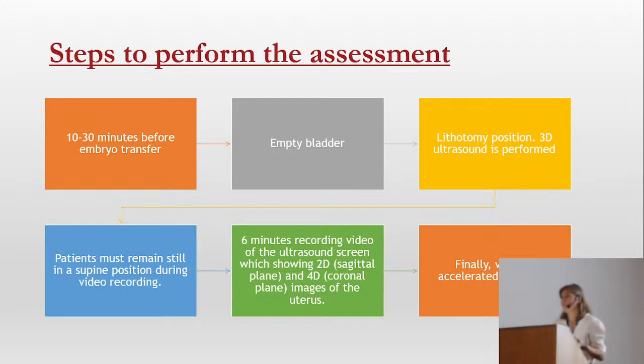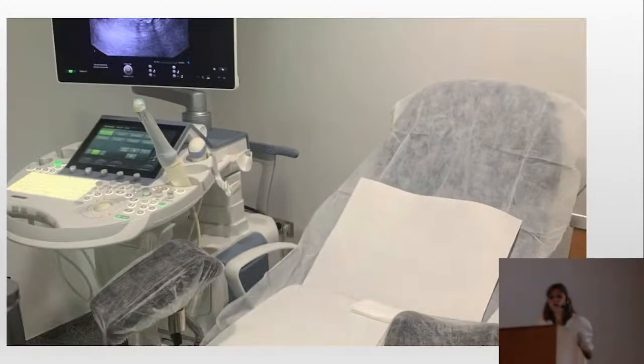That's why we assess 6 minutes, because theoretically one of these minutes cannot be assessed. But anyway, we record these 6 minutes, meanwhile doing the 4D ultrasound. Then we process the video and speed it up 15 times. So here is a video of how we are doing that.